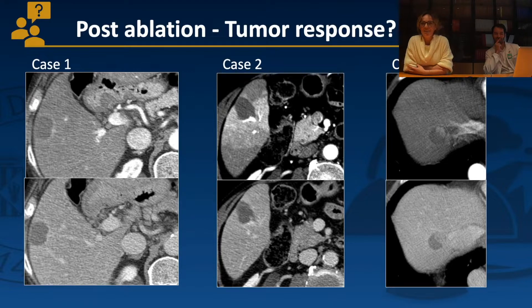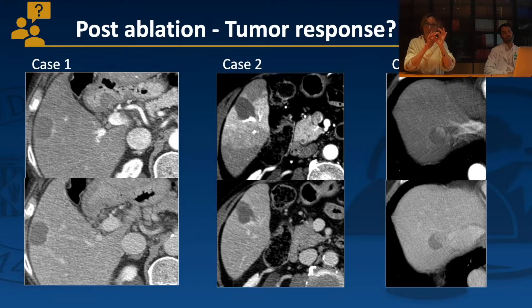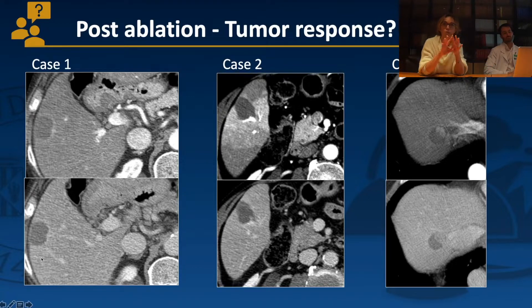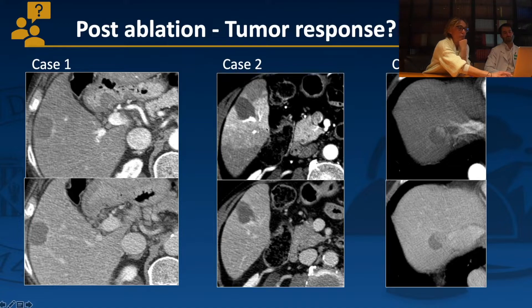Ablation cases: after microwave ablation, a thin rim of arterial enhancement surrounding the ablation zone is commonly seen. This is inflammatory, not tumor, because in the portal venous phase it remains hyperattenuating with no washout — unlike HCC which washes out. In a second case, a large enhancing area around the ablation zone in arterial phase also shows no washout in the portal phase, suggesting it is not tumor.